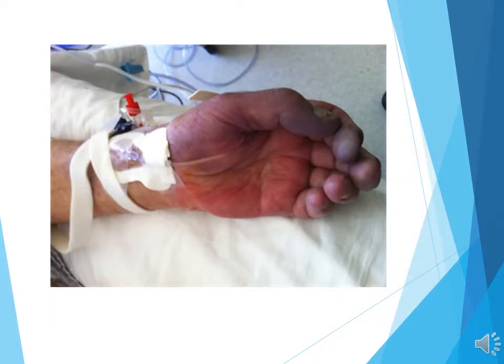This is an example of why neurovascular checks are so important. So make sure you can still get a good pulse on the other side of the ART line, and make sure you're always checking the circulation in your patient's hand and fingers. So check for cap refill, color, temperature, sensation, and make sure you're checking that pretty often because these can go bad quickly, and you never want this to be the case with one of your patients.